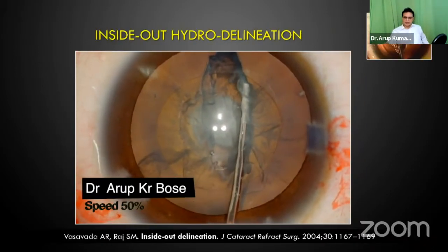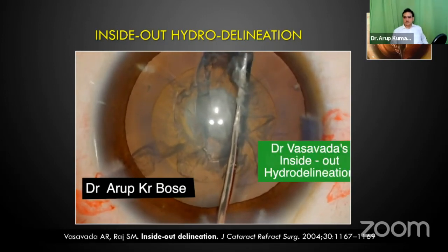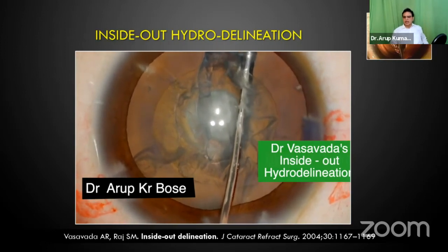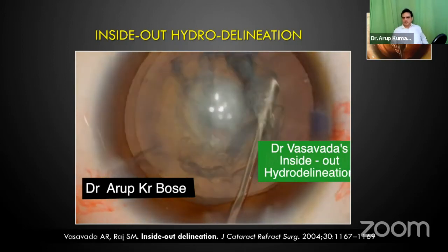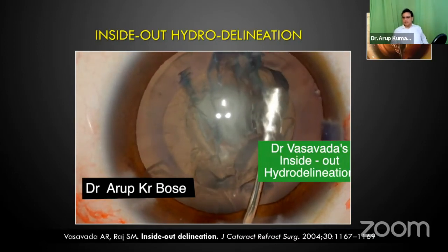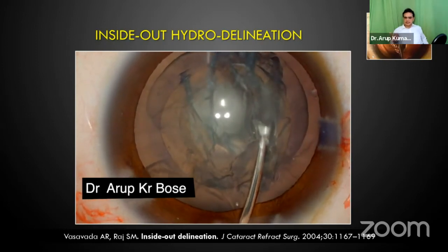And a very good technique, I've reduced the speed of this video to properly explain. This is Vasavada's inside-out delineation, which I have been doing recently. After having done the trenching, I try to find out the plane by a very small volume of injection in the epinuclear plane, and then once I get the plane, I inject further, and when I see that the central nucleus is popping up, I stop.